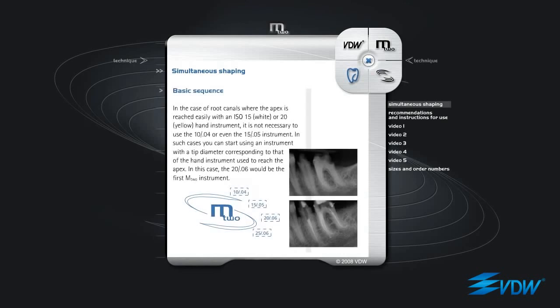In the case of root canals where the apex is reached easily with an ISO 15 white or ISO 20 yellow hand instrument, it is not necessary to use the 10 04 or even the 15 05 instrument. In such cases, you can start using an instrument with a tip diameter corresponding to that of the hand instrument used to reach the apex. In this case, the 20 06 would be the first M2 instrument.